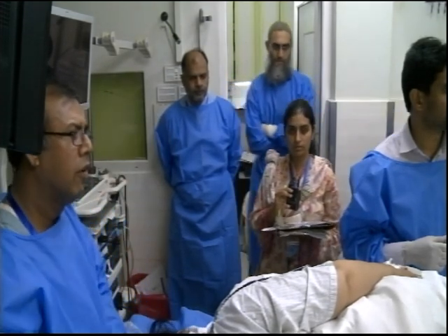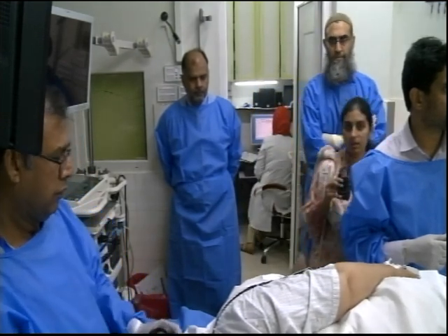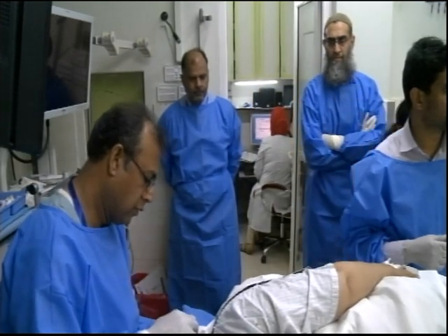Suspicion of GIST. Okay. Where is that? In the stomach, along the lesser curvature. Thank you.